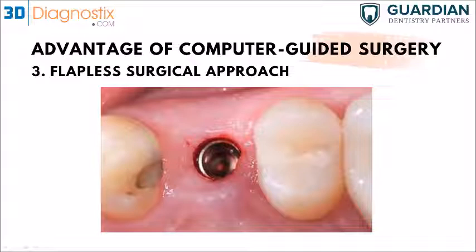How about anterior cases where the tissue is so important? What do you guys typically recommend? Well, we always recommend moving towards having a flapless procedure, because it's always easier for the patient, always easier for the clinician, and especially in the aesthetic zone. So we try our best, of course, to keep the sleeve without contact between it and the tissue, to have that flapless procedure done. So again, same concept. Once we've got the sleeve completely within the tissue, then we recommend using a tissue punch through the sleeve, taking out the tissue, and drilling the osteotomy.